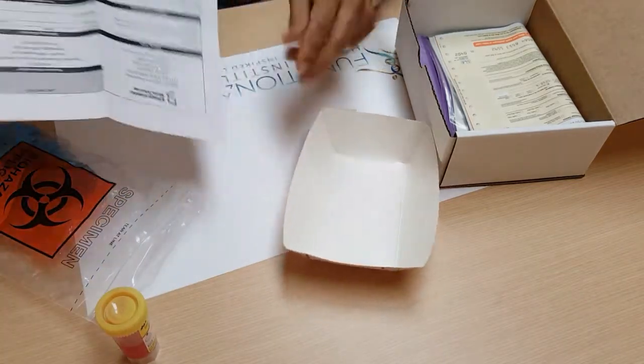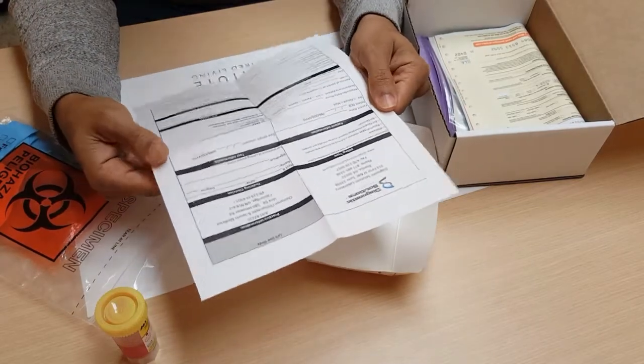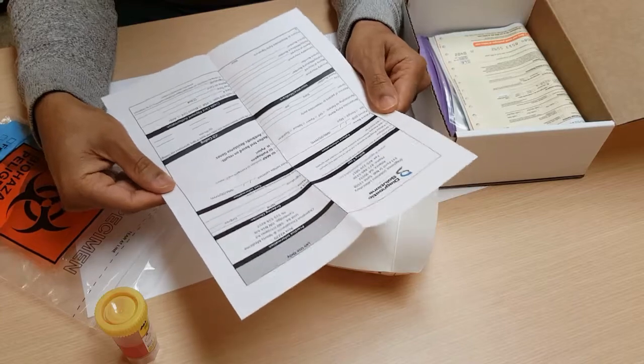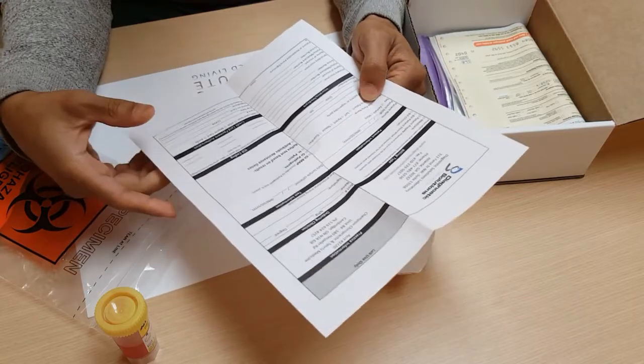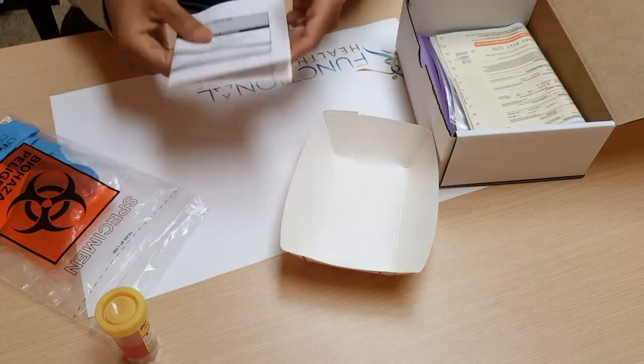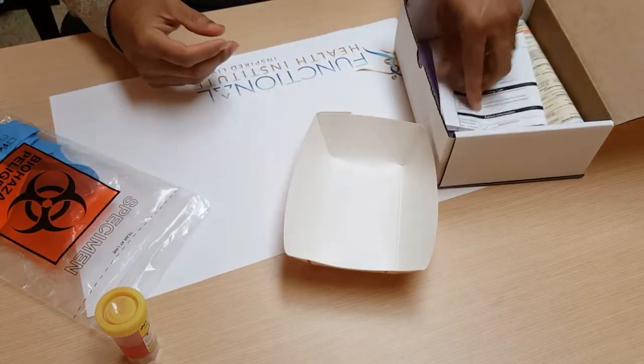The second thing is to fill out the lab requisition form. By the time you get it, the ordering clinician information will already be filled out. All you need to do is put in your patient information and the payment method. Once that's done, you can put the form back into the box.